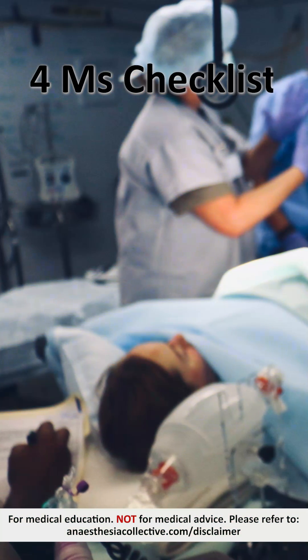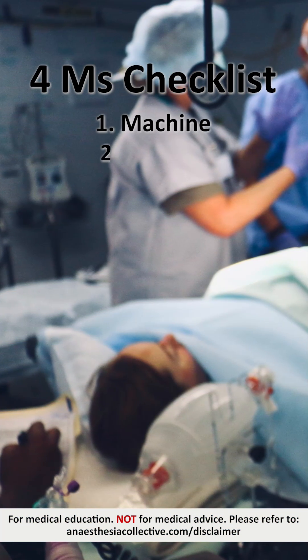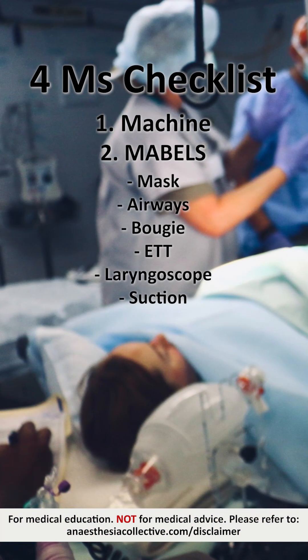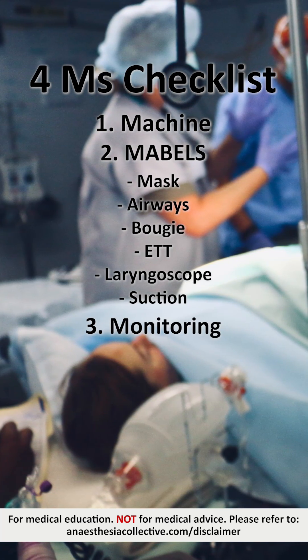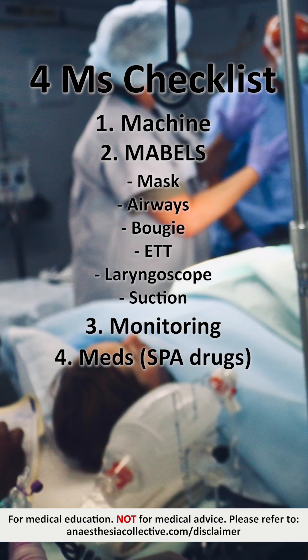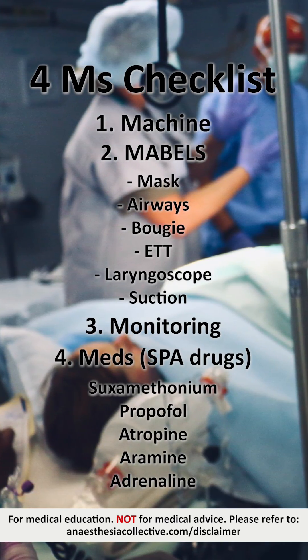And like always, your four Ms checklist. So your machine done. MABELS with your auxiliary equipment: mask, airways, bougie, ETT, laryngoscope and suction. Your monitoring, the standard. And also your meds, which I call the spa drug: sux, propofol, atropine, aramine and adrenaline.